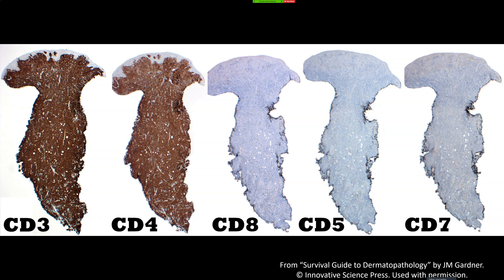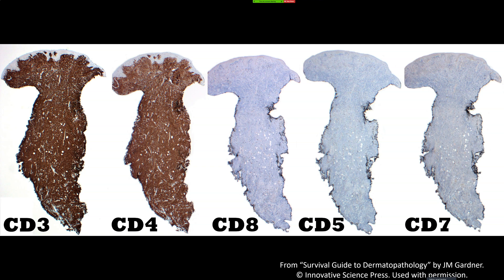Now look at this immunostain panel — it looks easy, right? CD3 is positive, so it's T-cells, and you can see some Pautrier micro-abscesses. They're nearly 100% CD4 positive. There are only a couple of CD8-positive cells, which are probably just the background non-neoplastic T-cells. Those same CD8-positive cells are positive on CD5 and CD7, so those few are normal. Everything else shows complete CD4 dominance — way outside the normal four-to-one ratio. CD5, normally positive in T-cells, is completely lost. CD7, also normally positive, is totally wiped out.